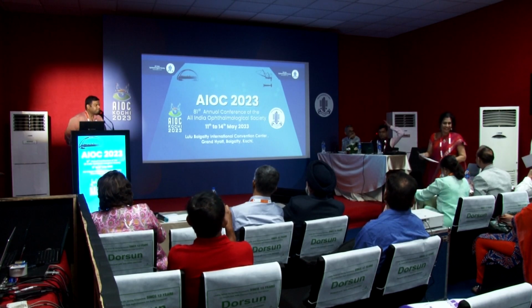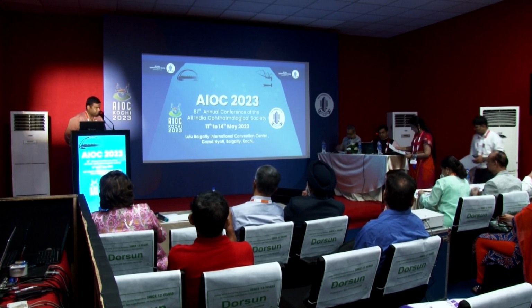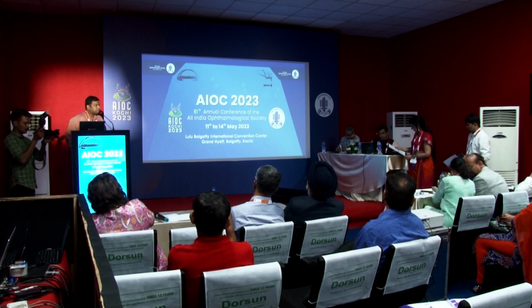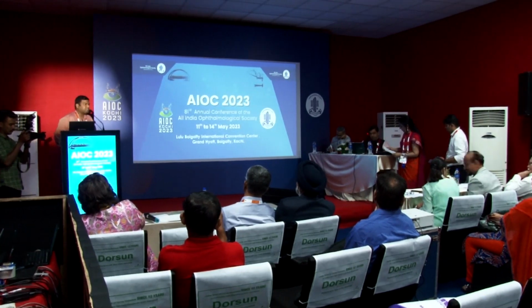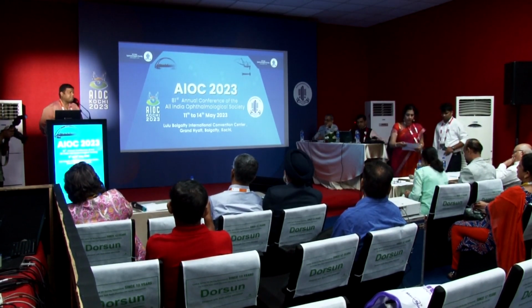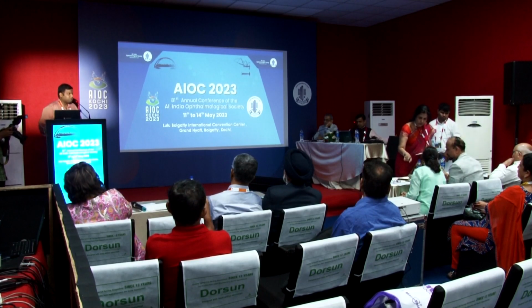You have to increase your sample size, and also the fact that since you are placing such a high-powered plus lens in front of the eye, there might be a possibility of artifact, because the light rays traveling through such a high-powered lens might... True, sir. The signal strength reduces a bit.